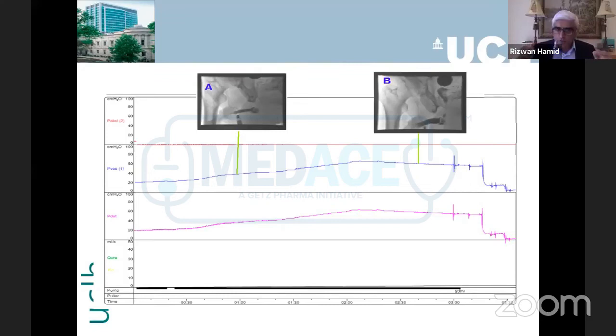And the importance of this in this case is that if he is leaking and having stress incontinence, then if you want to do something, you have to either upsize the balloon or downsize the sphincter to increase the pressure. If he didn't have an artificial sphincter, and let's say he leaked at around 40 centimeters of water, you know the external sphincter is weak, and then you offer surgical treatment.